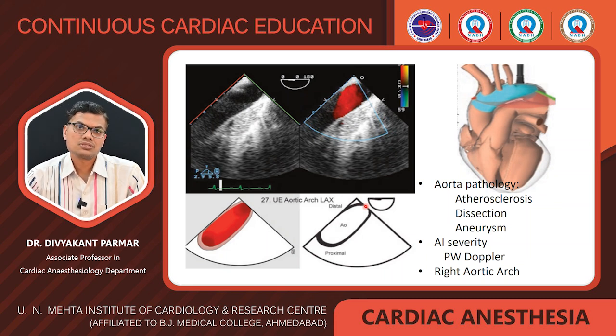So this view is useful for atherosclerosis, any dissection or aneurysm of the aorta or the arch of the aorta. And if flow reversal is present, then it will suggest aortic regurgitation. In case of a right aortic arch, we can see this oblong shape here on the right side of the display.